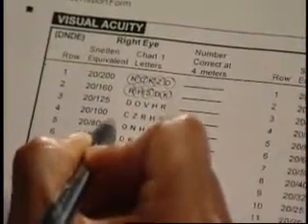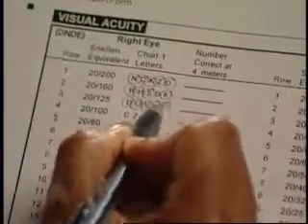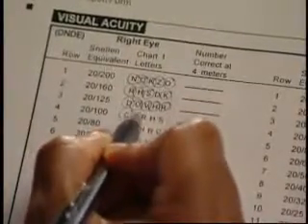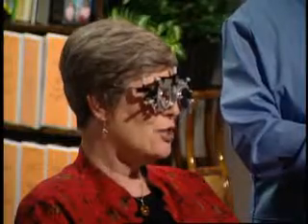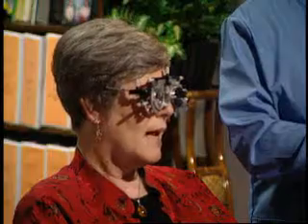Oh no, wait a minute. That's not an O, that's a D. Okay, keep going. D, O, V, H, R, C. And if the subject can't make up their mind, encourage them to choose a letter. O, N, H.